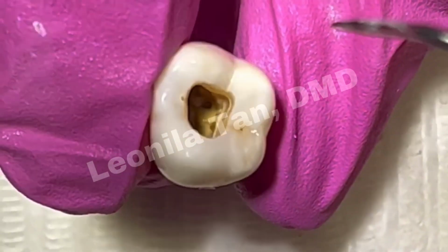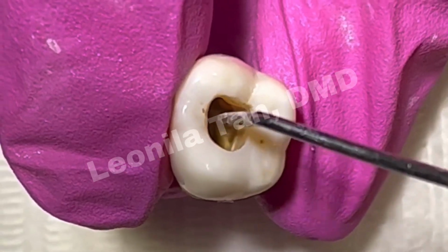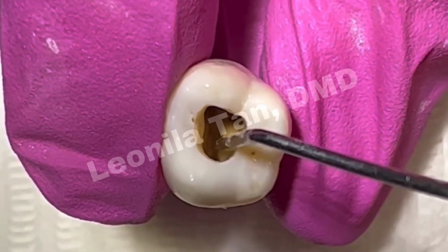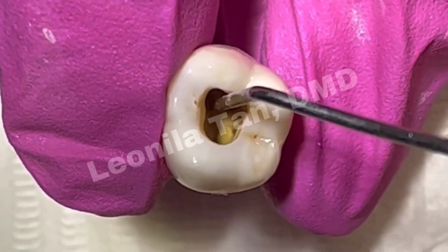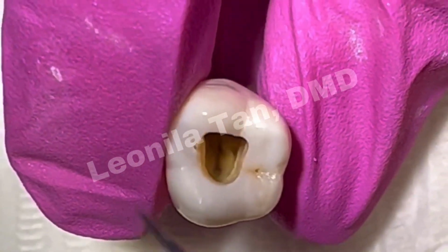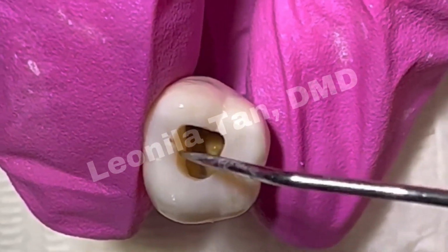That's your dentinal map. And you maintain that because that represents your bifurcation area. You do not flatten. You maintain that form, because if you flatten that, that means you also thin out your bifurcation area. And also, you don't gouge the walls.